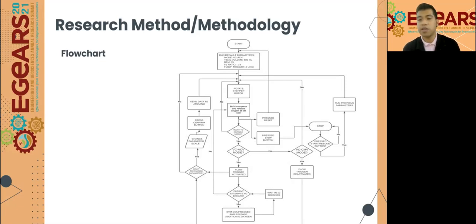In VC-ACV mode, the flow trigger is activated. So during the expiration phase, if the patient attempts to breathe, the ventilator will provide another set volume of oxygen that is synchronized to the patient's breath. Then if there's no other breath initiated by the patient, the ventilator will go back to the set frequency in the machine. In VC-CMV mode, it has the same operation as VC-ACV, but the difference is it has no flow trigger, or the flow trigger is deactivated. The control also has reset, stop, and start or resume buttons.